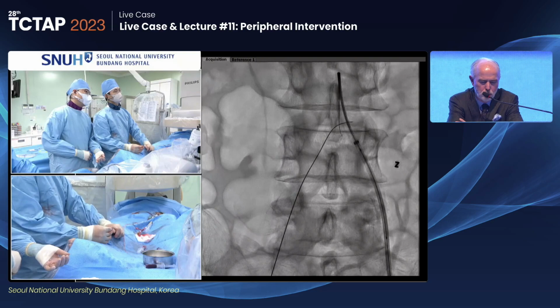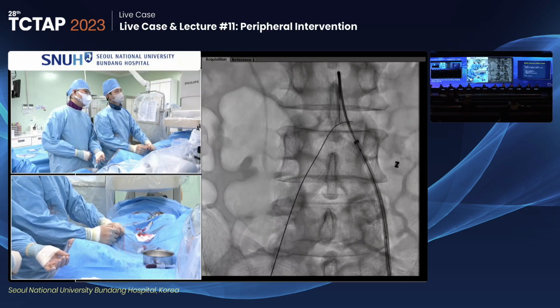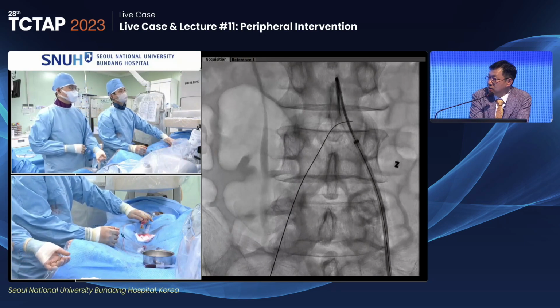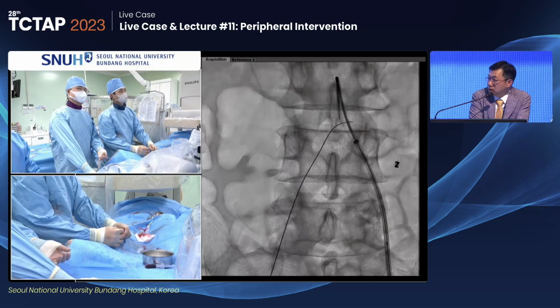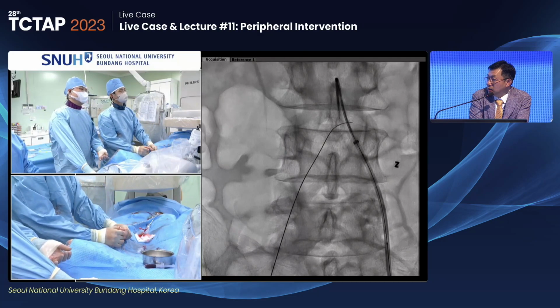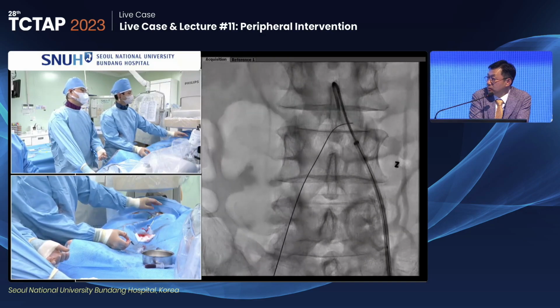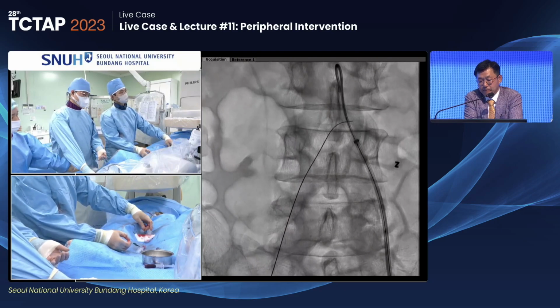The only way to manage that kind of situation is a proximal balloon dilatation. In a severe emergency situation, distal aortic balloon dilatation, and then we are going to manage the next step. Because in the afternoon, my student presented a case.